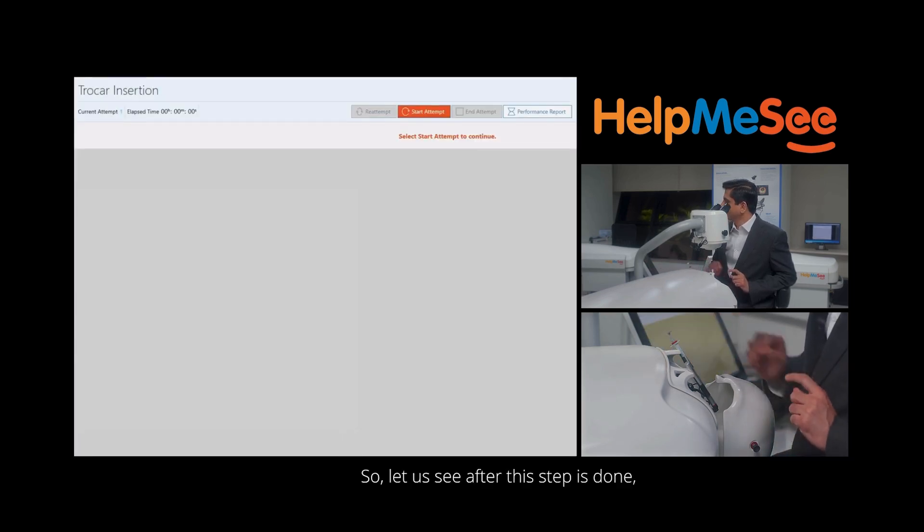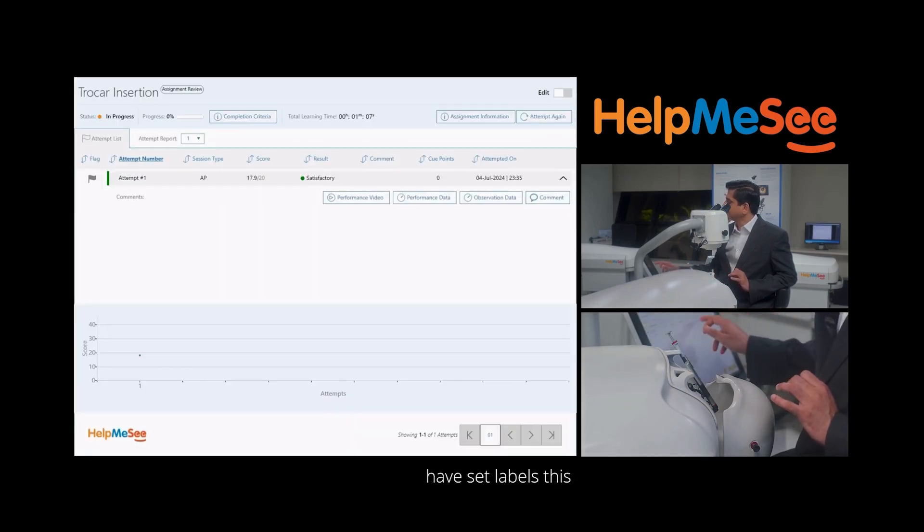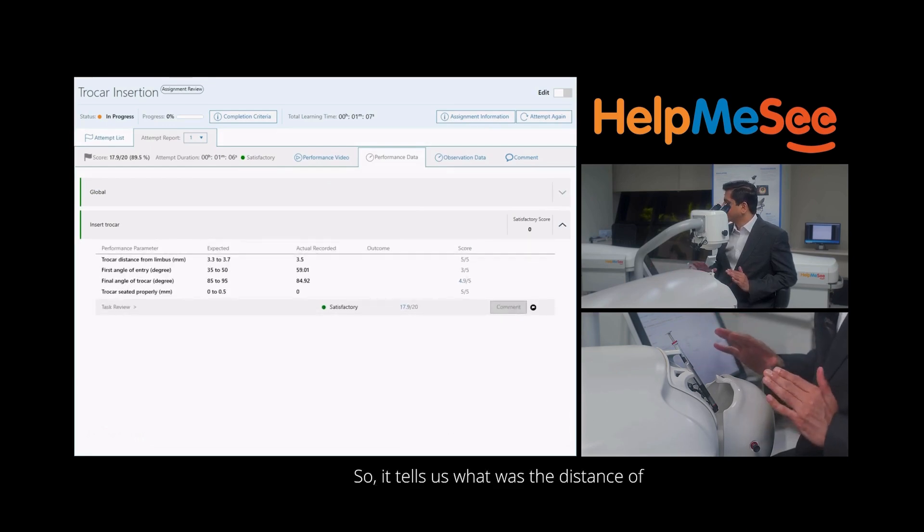After this step is done, the performance data will indicate how well we have done this step. It will label this step as being satisfactory or unsatisfactory based on the criteria that we have set. It tells us the distance of the trocar from the limbus, the first angle of entry, the second angle of entry, and whether the trocar was seated completely perfectly on the sclera.